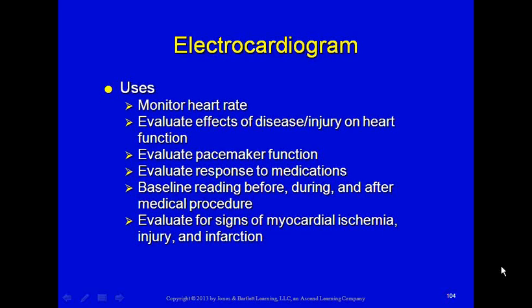We can use it to monitor heart rate, but when you look at your heart monitor, it's going to tell you what the rate is, but that's not always accurate. So you always need to confirm what you're seeing on the monitor with what's actually happening with your patient. So if I'm looking at the monitor and I see that there's a rate of 80, I'm going to feel for a pulse to verify that I in fact have a pulse of 80.